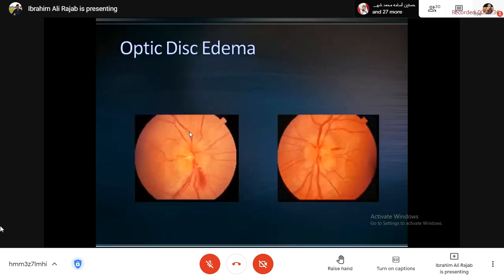Hello. أيان مكتوب optic disc edema فالتشخيص واضح بس احنا ما نريد نعرف التشخيص لأنه هو مكتوب نريد your description, how to describe this image. هي اثنينهم. Yes, both of them. Any one of you, مثل ما بدت آمنة شلون بدت آمنة you should start like آمنة عيسى. نقول إنه the optic disc is not clearly demarcated.